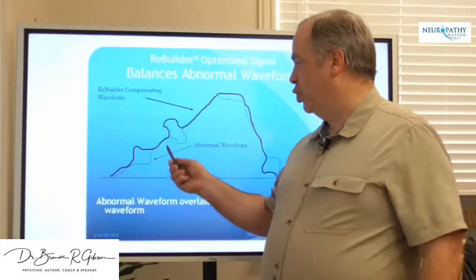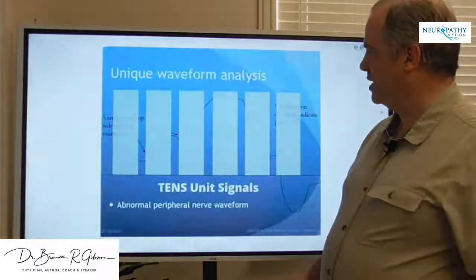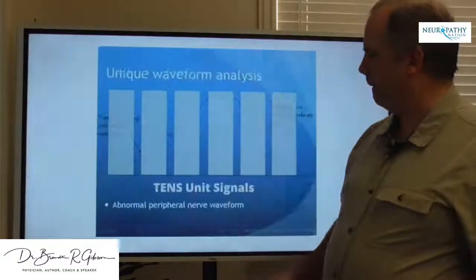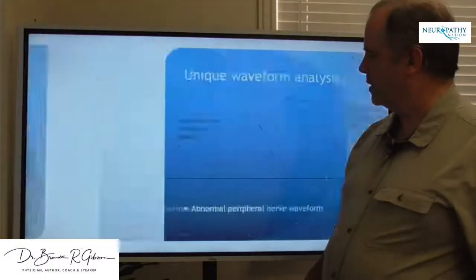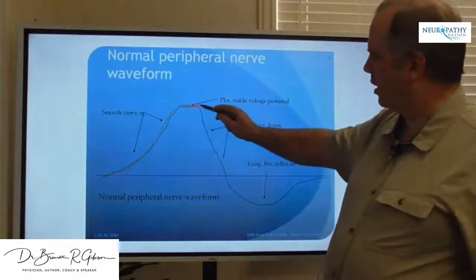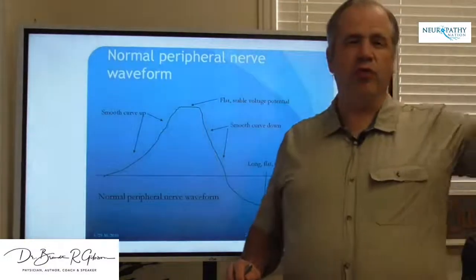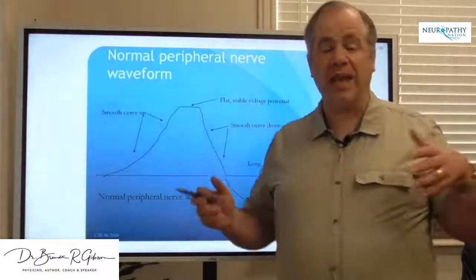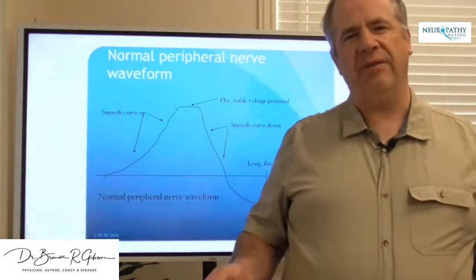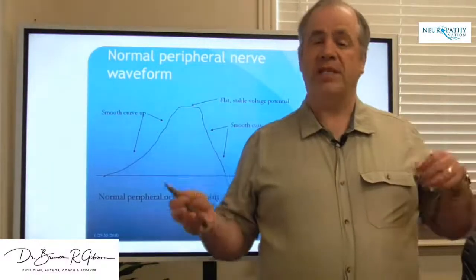So again, what you're doing is you're adjusting it so that instead of having those abnormal signals like the TENS unit, you get it to more the smooth curve with the flat top, smooth curve down, exactly like you would expect. So true reflex arc. And because of that, you get really good relief and ultimately can start to improve the functioning of the nerves by this process of re-education.